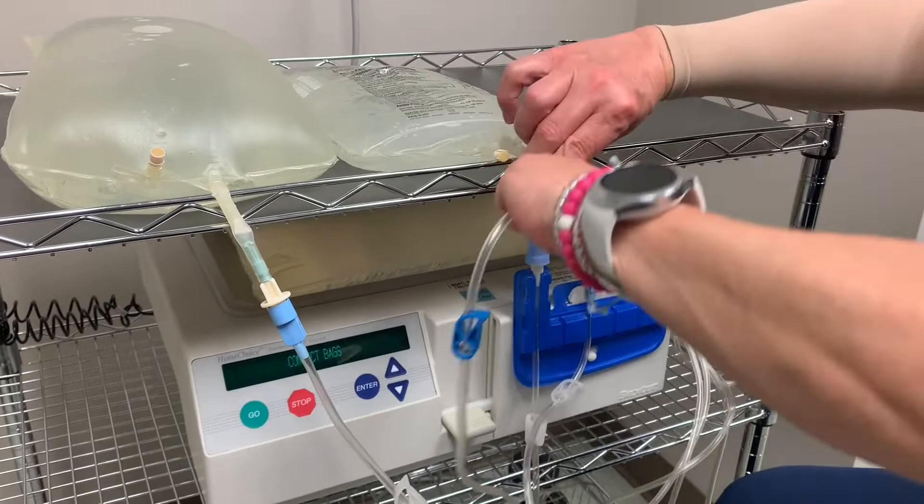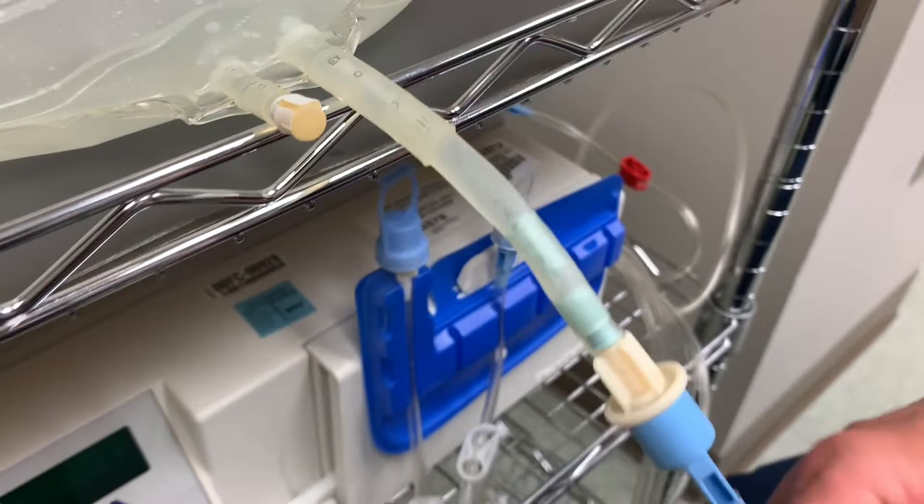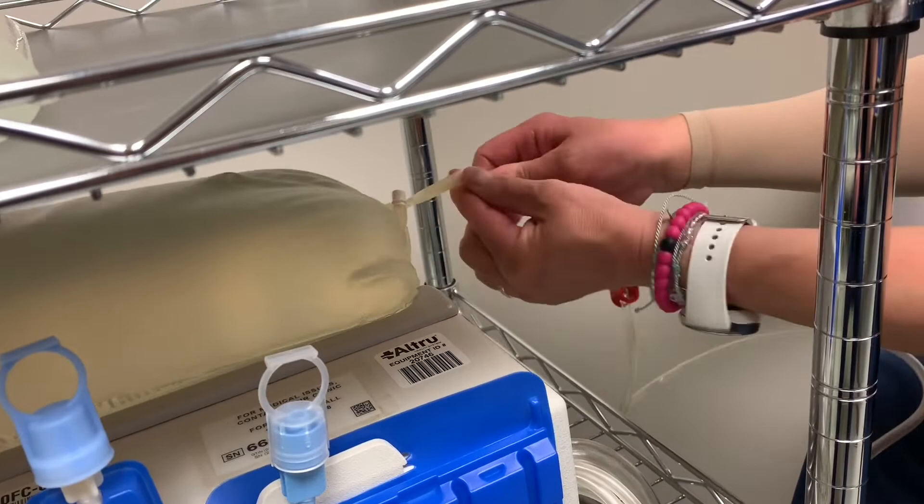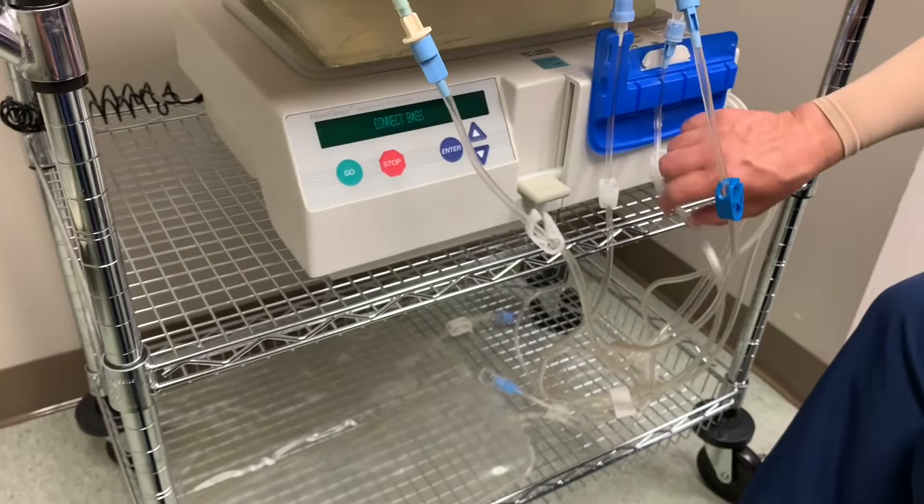Open the clamps — break your frangibles. Make sure there's good space in between, open the clamps, break the frangibles. Open clamp, break frangible, open clamp. The last line is still clamped, and the patient line is open because you want that to prime.